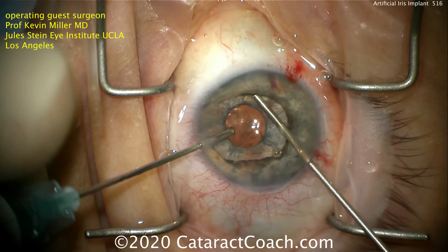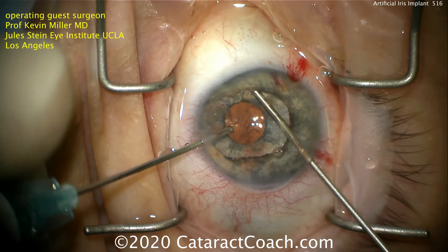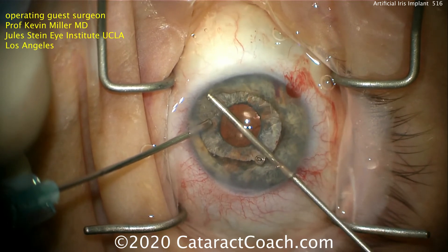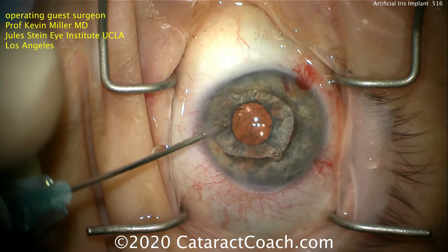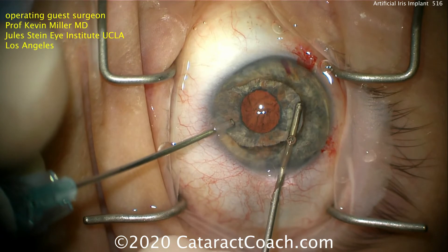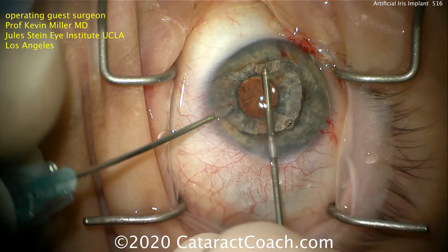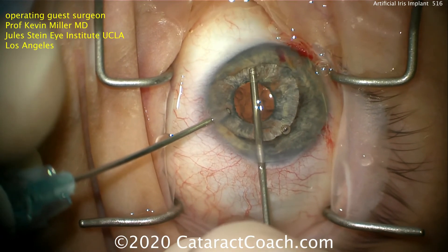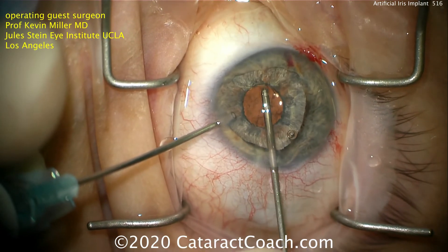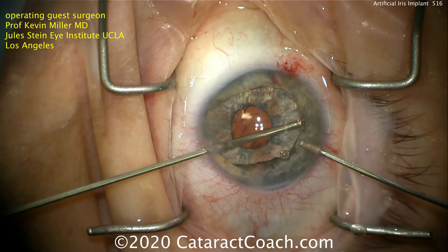Now, in a brown-eyed person, this probably wouldn't matter much because it would be very difficult to see. But this is a patient who has very light blue eyes — the other eye in this patient is a very light blue color — and if we leave this dark pigment there, it'll be noticeable. Look how nicely it's cleaned up just by using that vitrector. We still need the iris there to form the sulcus, but it's just this margin here that Dr. Miller carefully removes — that darkly pigmented edge — and that allows this new implant, the Human Optics artificial iris, to very nicely blend in with the remaining iris tissue.